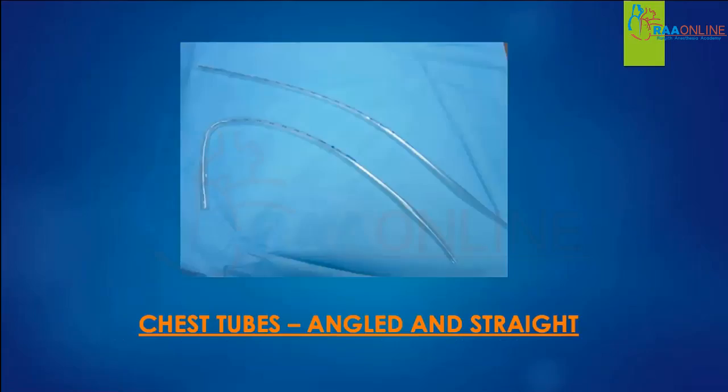Now, there are various types of chest tubes available to us. They can be angled or straight. In this picture, I have shown you an angled tube at the bottom and a straight tube.